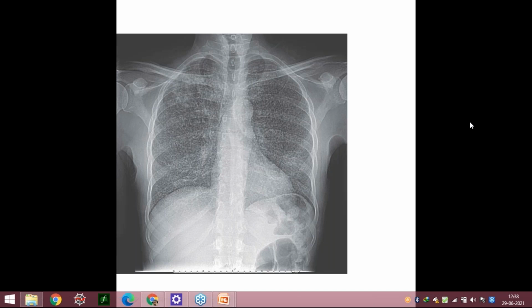The CT may pick up those ground glass opacities. So all those mild categories, the CT severity scores that you may have heard of, going up to 6, 7, 8, may have a normal chest X-ray. So yes, GGO is a CT finding, but it can be picked up on X-ray. If it is, let's suppose, a CT severity of 15, you will find ground glass opacities on X-ray as well. So my point, which remained incomplete.